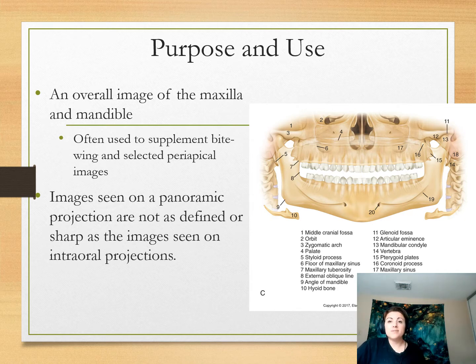I was in private practice. I took a couple of bitewings and PAs on patients. I took an FMX on a new patient who came in, and we saw this sort of corner. It was dark. It was radiolucent, and we were like, "Hey, what the heck is this?" So we took a pano on him, and it turned out he had a very, very large cyst growing back toward the bottom of his ramus, and he ended up having a dentigerous cyst around a third molar that he'd never had removed, and he could have fallen down and hit his jaw, and he would have broken his jaw.